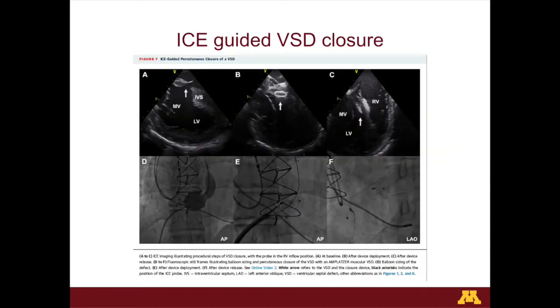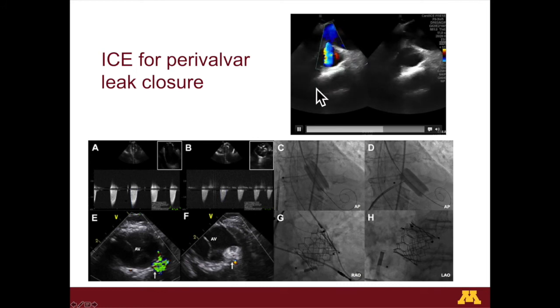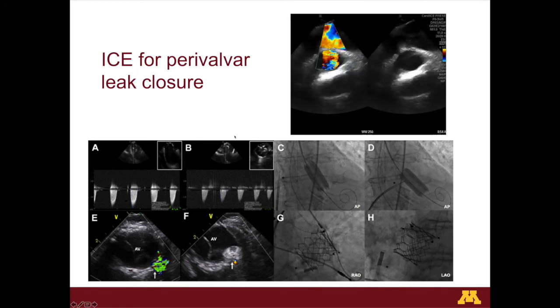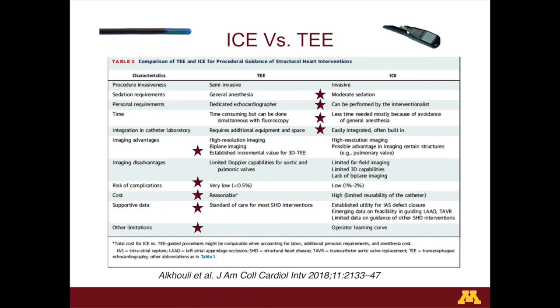ICE has been described in use of VSD closures. It has been used extensively in perivalvular leak closures, as shown in one of my patients here, especially in the anterior perivalvular leaks where TEE may not show us well. ICE is extremely helpful.